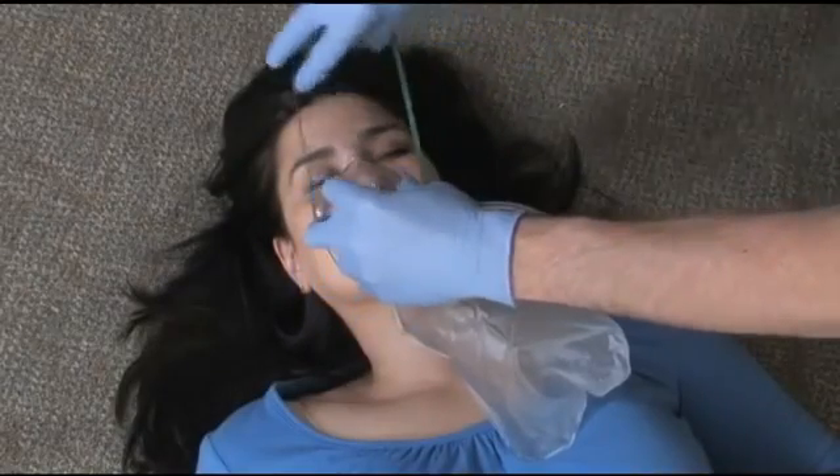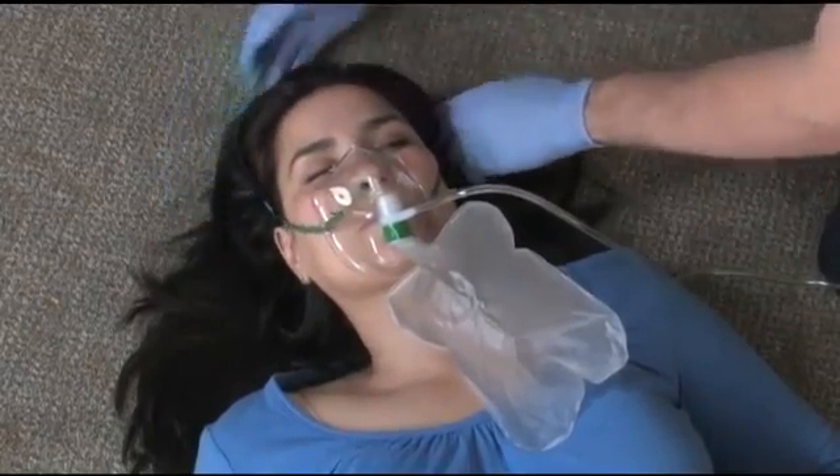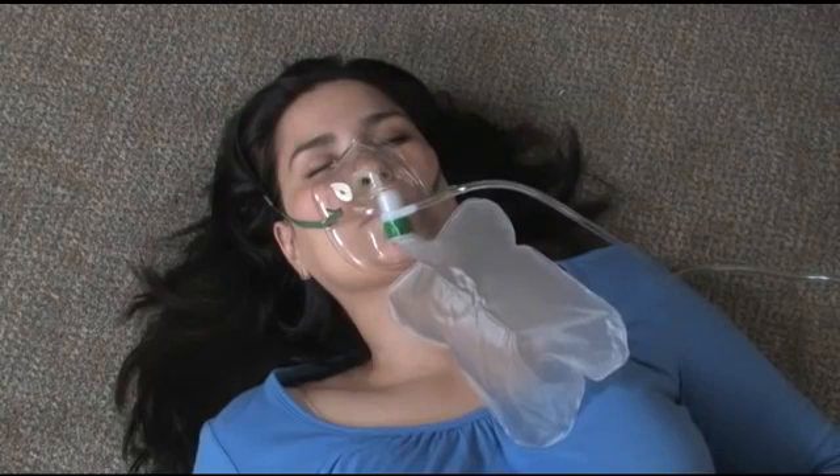The liter flow for a non-rebreather should be between 12 and 15 liters and should not be allowed to go below 12 liters. A non-rebreather mask will provide concentrations of oxygen ranging from 80 to 100% depending on liter flow.